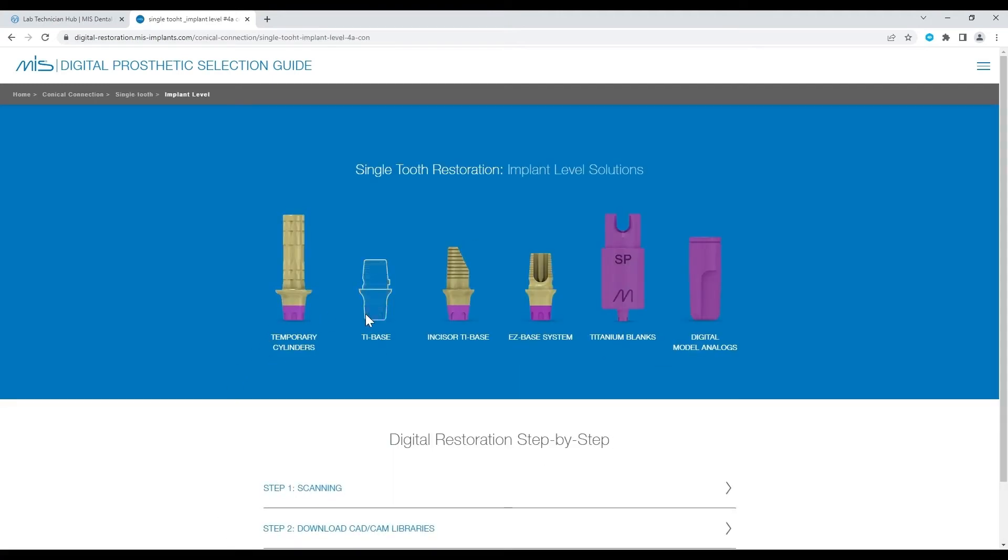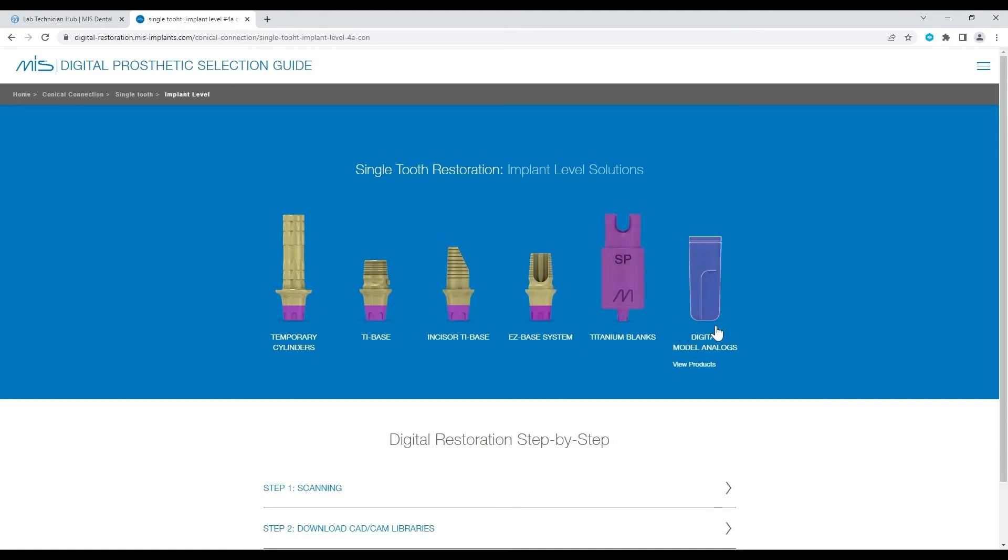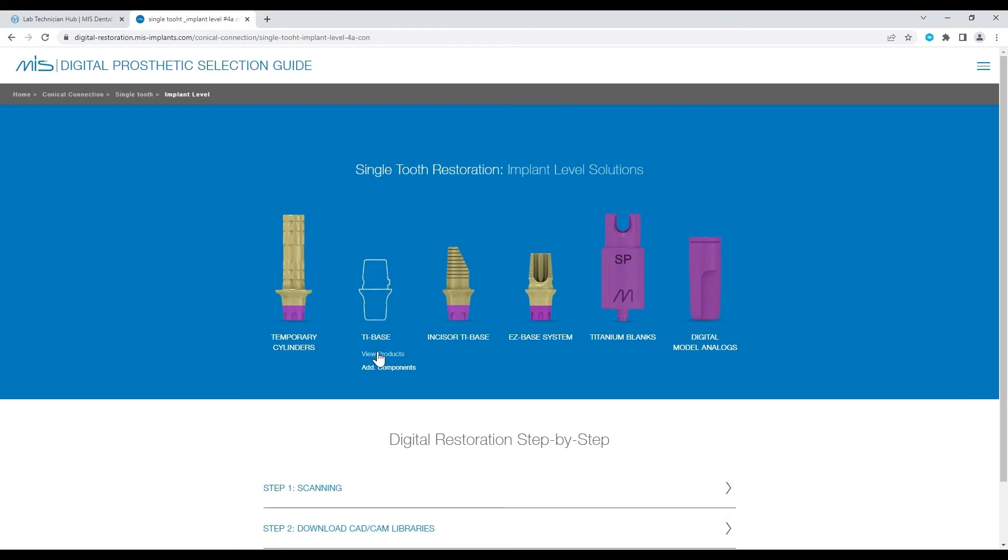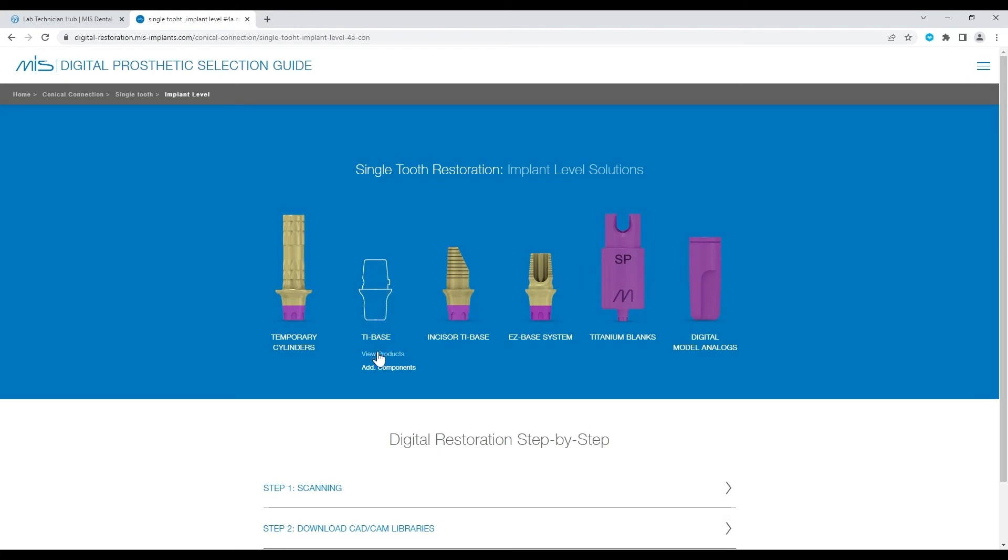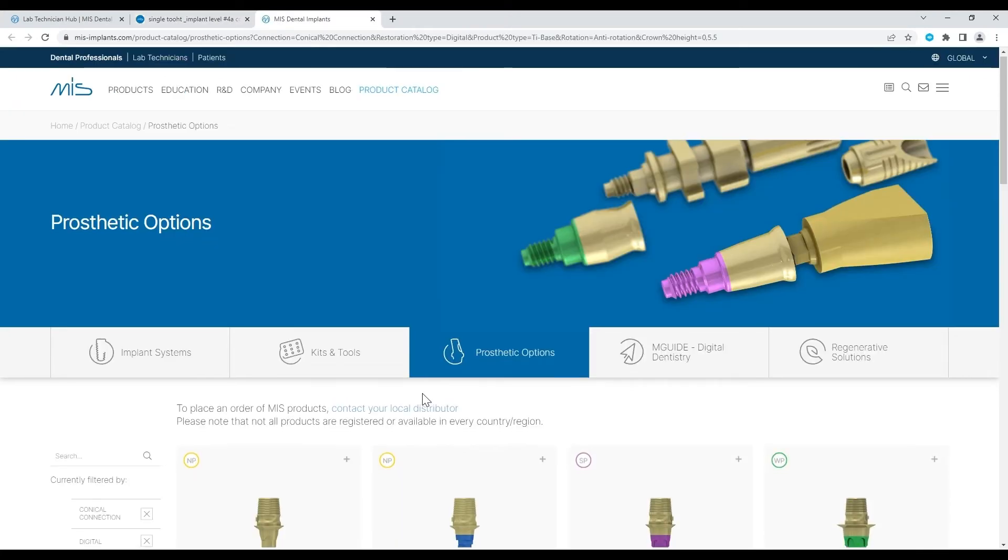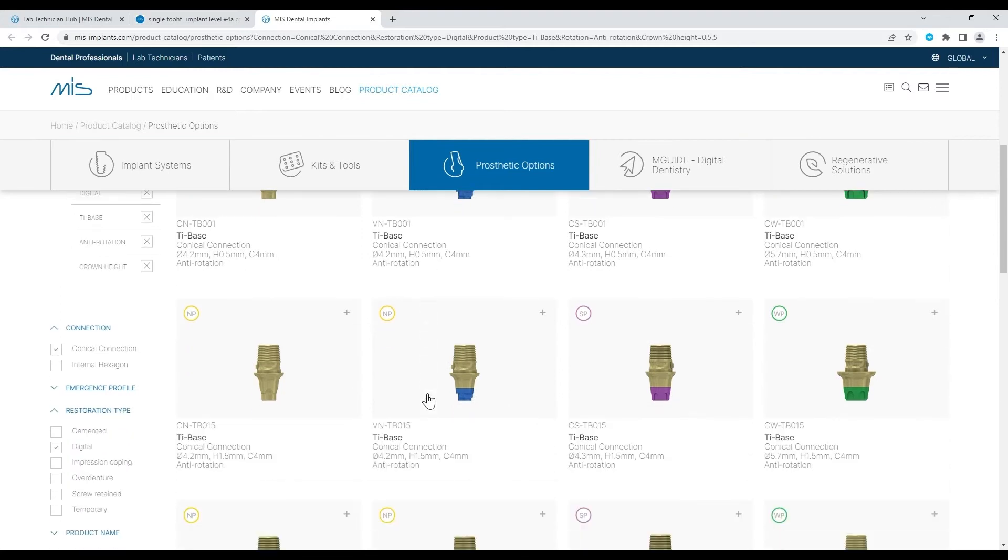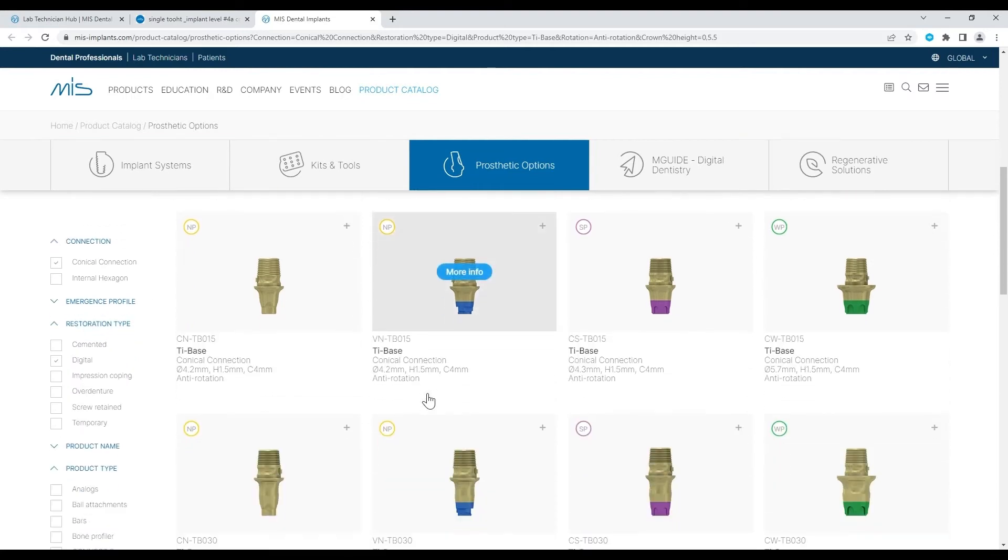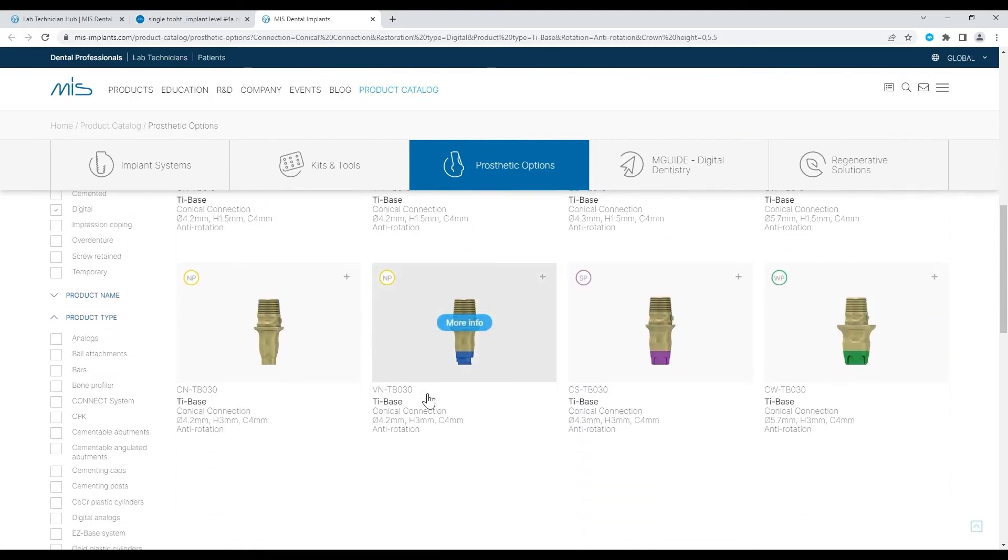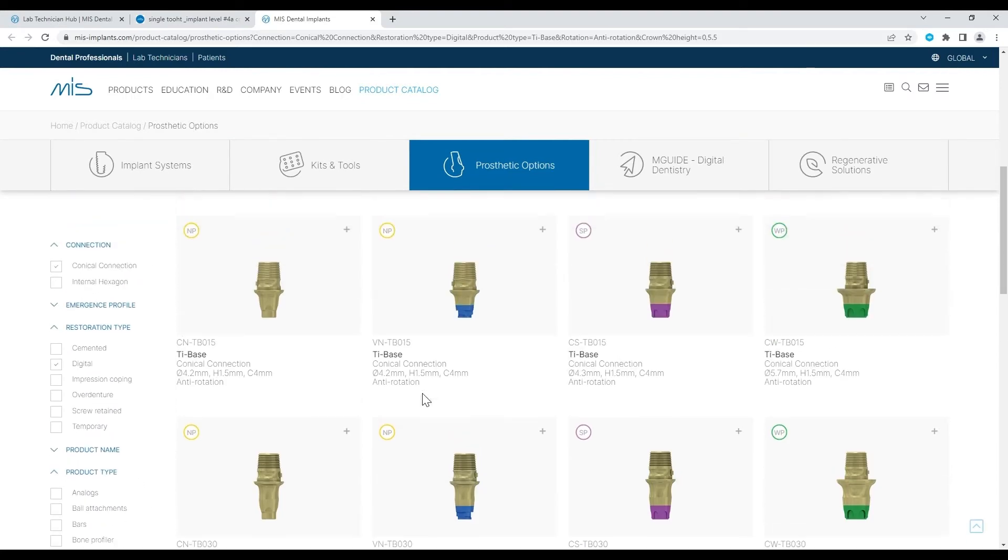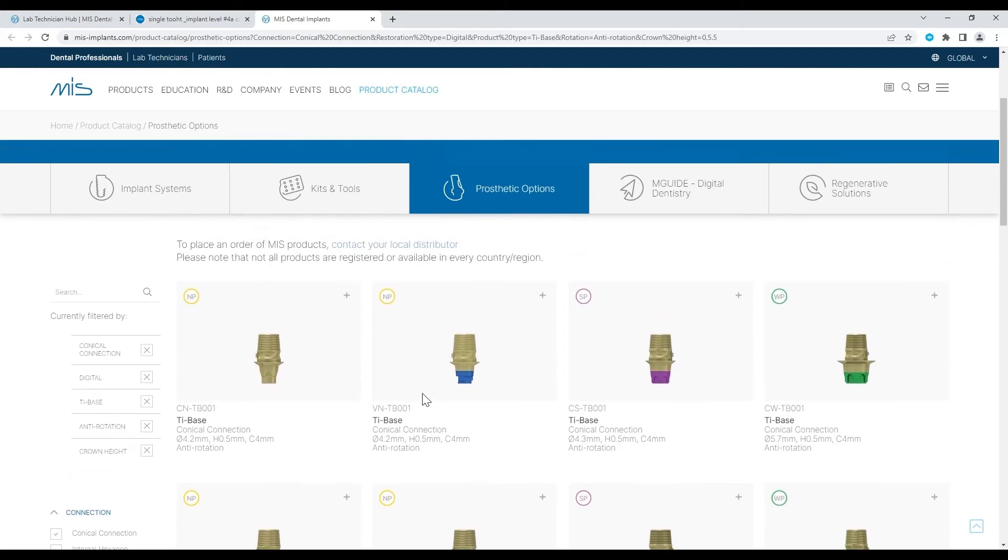You may now choose between the different abutment options for a single tooth implant level restoration. Choose an abutment and click on View Products. This will lead you to the product catalog on the MIS website, where you can see all the options for that specific abutment.